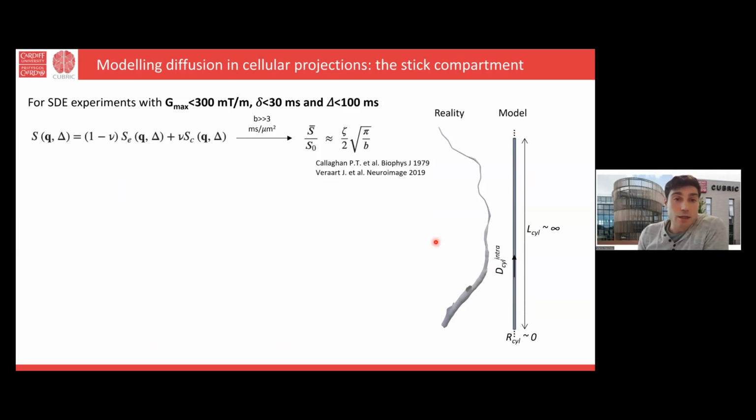Now, what is the cool feature of diffusion inside sticks? If you go at very high B value, the signal functional form is very peculiar and characteristic. The signal at high B scales like 1 over square root of B. So as a form of validation of this model assumption that the fiber can be approximated as a stick, one way is to just push your B value very high and see if you get this characteristic scaling with the B value.